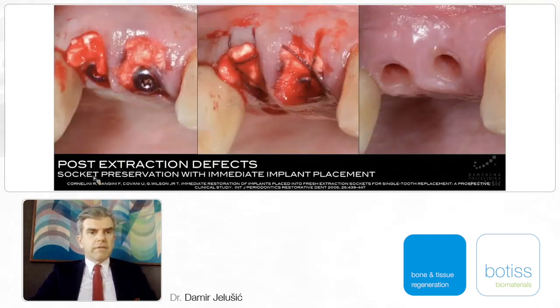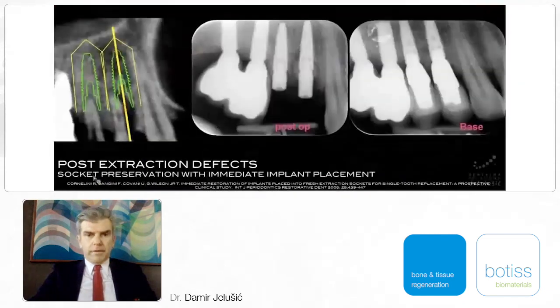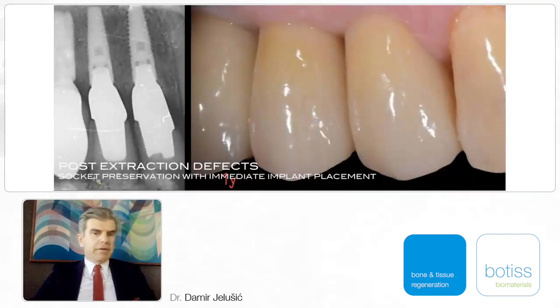Stabilization with Jason fleece, development of profile, and single crowns on single implants, and also here nice situation, and even 1 year later, no retraction in the inter-implant area.